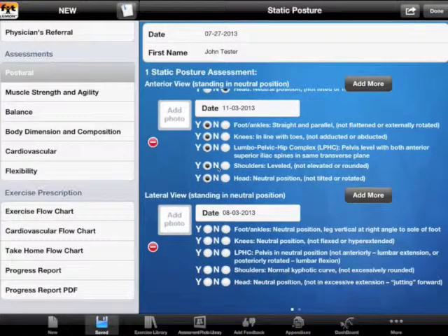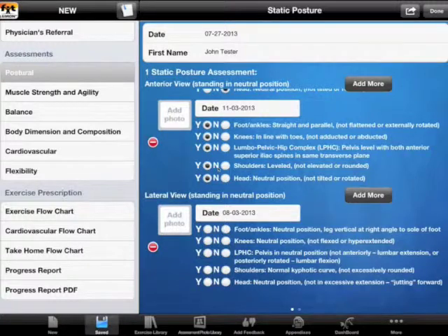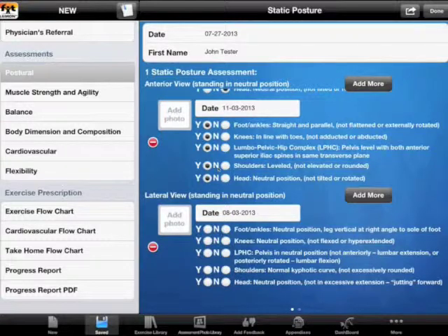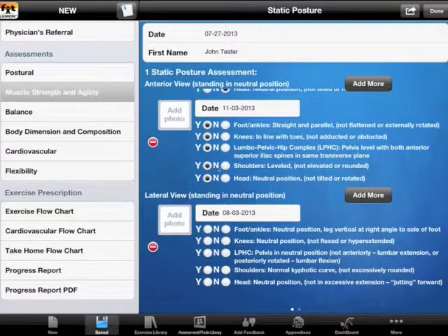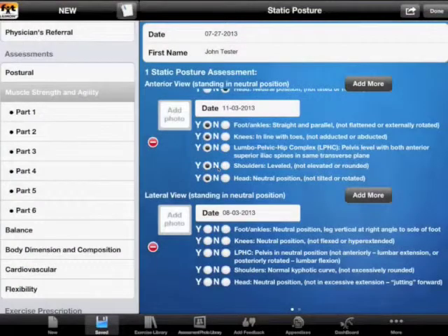Welcome to LUMON fitness instruction videos. Today I will talk to you about muscle strength and agility assessment. We have our John Tester loaded in here already. On a previous video we did postural assessment, so we have all that data stored in the application. Let's proceed to muscle strength and agility assessment.